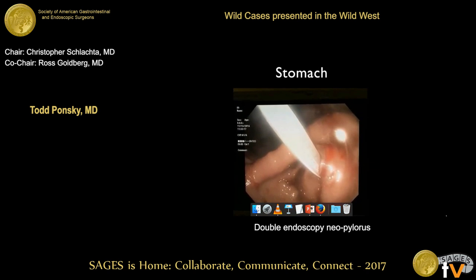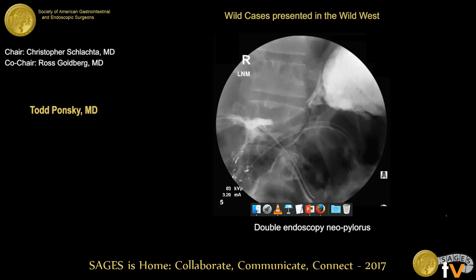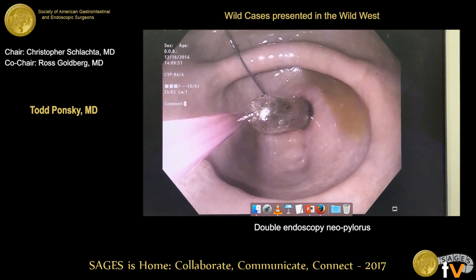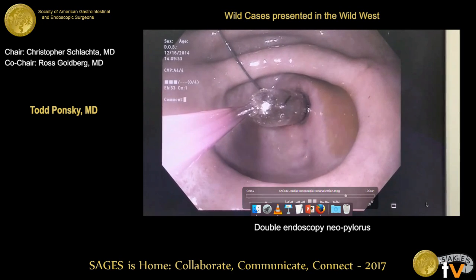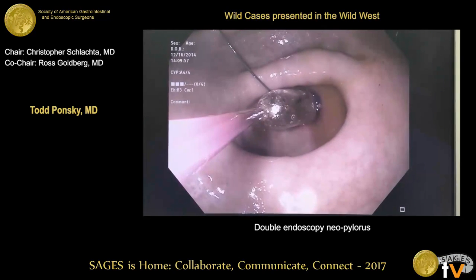Distal endoscope was used to position the tube in the small bowel. Post-operative fluoroscopy and abdominal radiograph showed no evidence of leakage or pneumoperitoneum. Serial endoscopic dilations were performed every 1 to 4 weeks with a maximum balloon size of 18 millimeters to expand the pylorus and prevent restricturing.